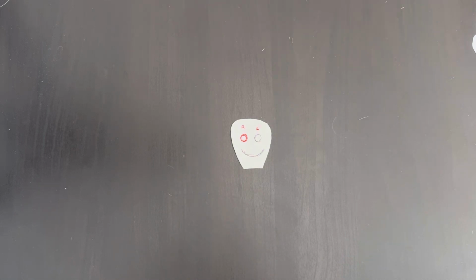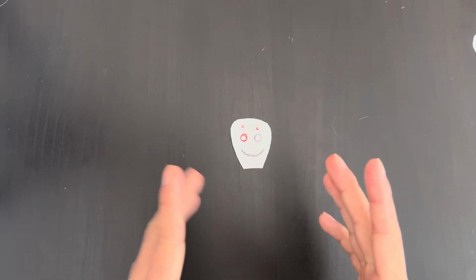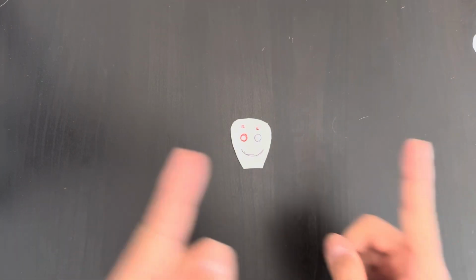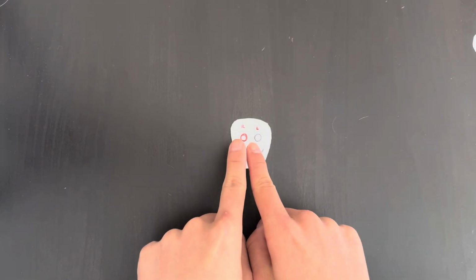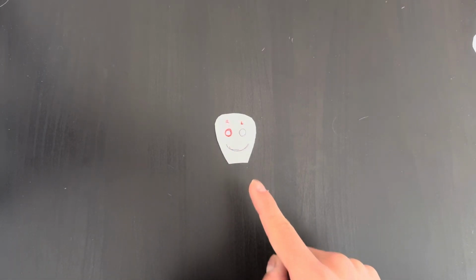My patient has a red right eye. I am looking directly at the patient across from me. From my perspective, I see the red eye on my left side. But I know I see the world 180 degrees flipped. So my left side is the patient's right side. And so I would describe this patient as having a red right eye.